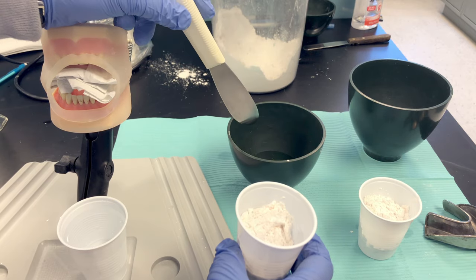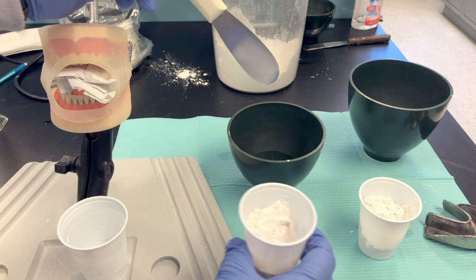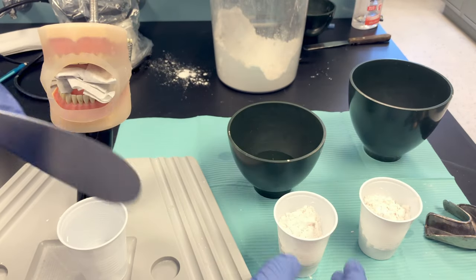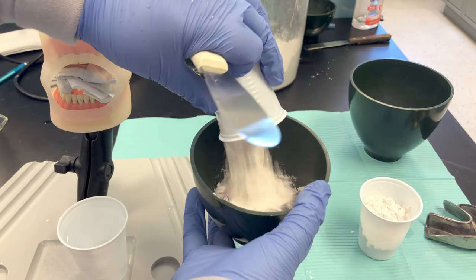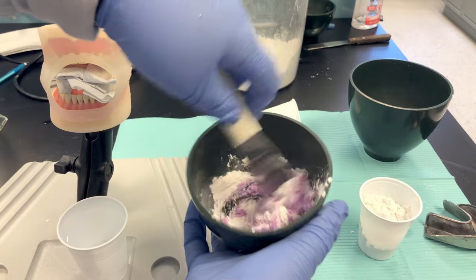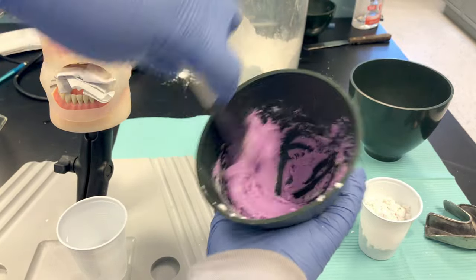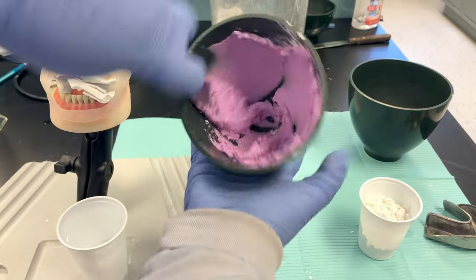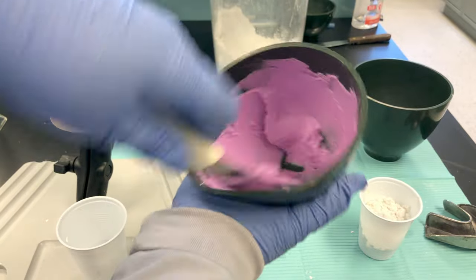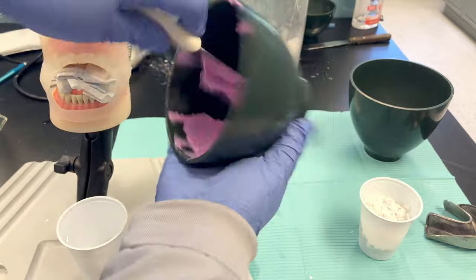Once you add powder to water — always add powder to water — stir to incorporate the powder, then mix very vigorously by pressing the spatula against the wall of the bowl. Chroma Clone changes colors: it starts out dark pink and gets lighter. Once all the powder is wetted, turn the bowl and press the spatula firmly against the sides — rotate and press. Wipe the spatula on the sides of the bowl; that pressing action happens very fast.